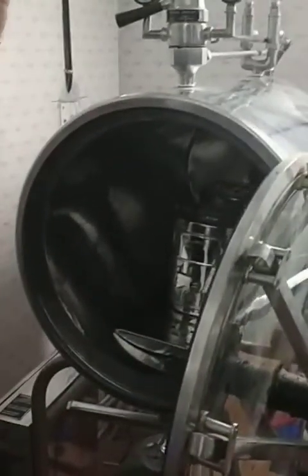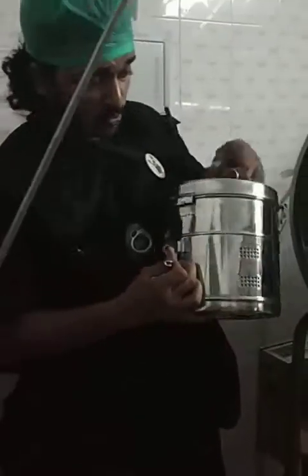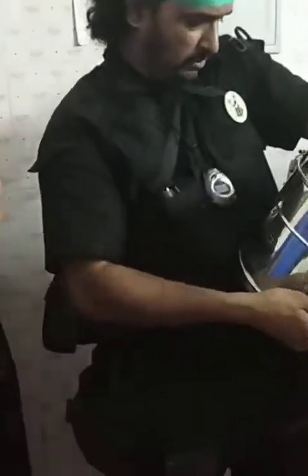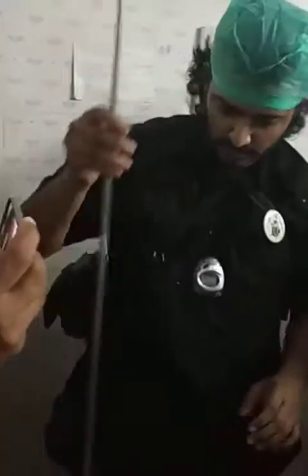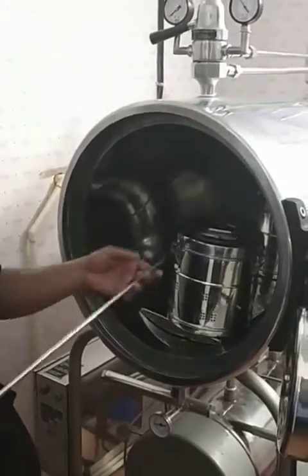Oven gloves are the best — you can use them for your hands to get the bins out. If the cycle had been completed, I would have taken the bin out, closed it, and shut it. Now because this was just an explanation, I am going to keep it inside. There is a provision specially to remove the sets, because everything is going to be very hot, but you still need something to protect your hands.